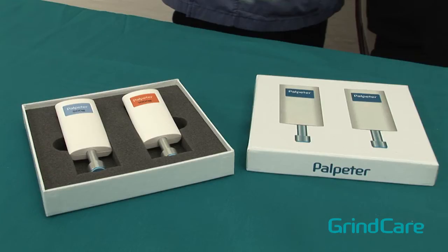Palpeter is a mechanical algometer for perfect, repeatable palpation. It is used for diagnosis of temporomandibular joint disorders, pain assessments, or documentation of patient progress based on your treatment plan.